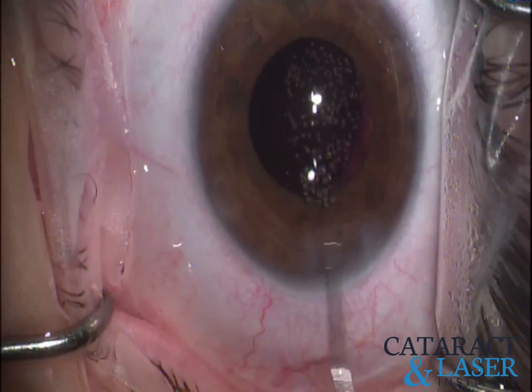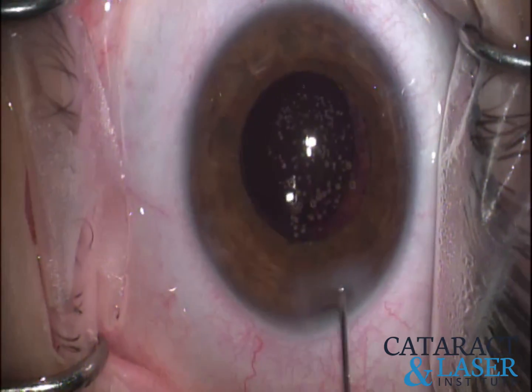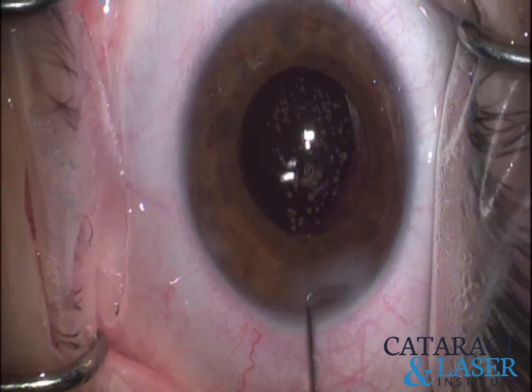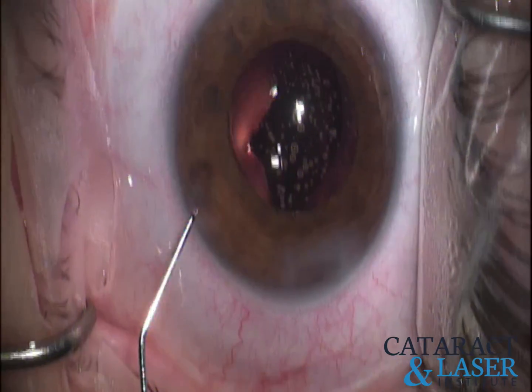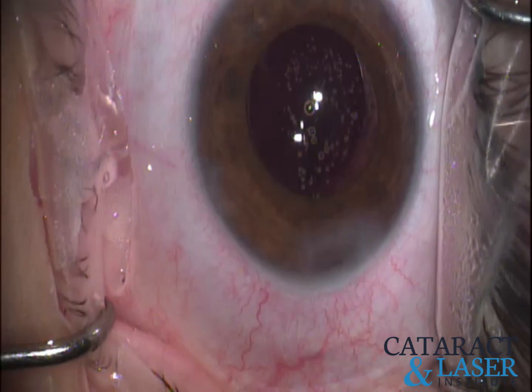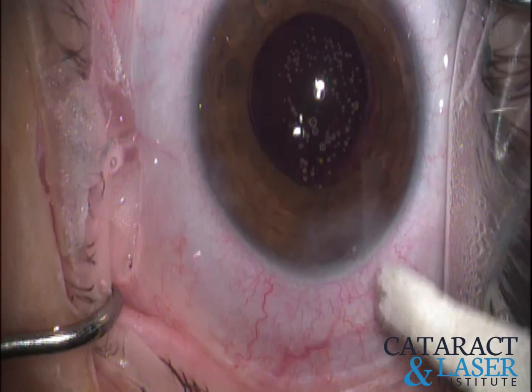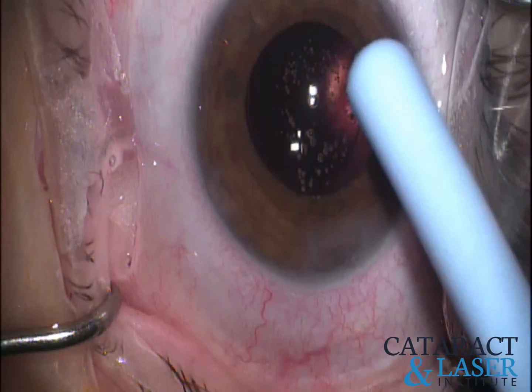Lightly hydrating our wounds — I go straight for the roof of the main incision, which usually does an adequate job of making it nice and watertight. A little hydration to the secondary incision as well, but since so little movement was done, we don't have to worry as much about that as we normally would. And there you go — nice and watertight with a good pressure.